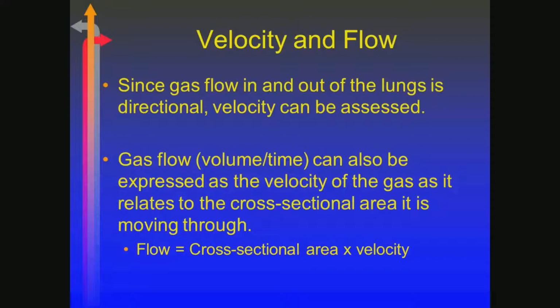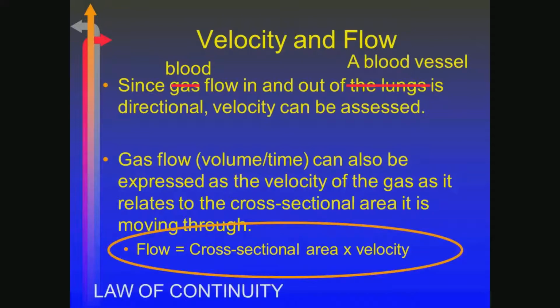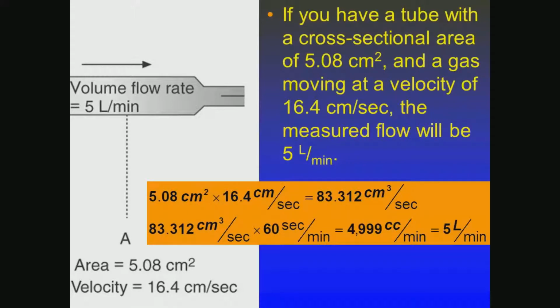The problem with the technology is we're making the assumption about the cross-sectional area of a person, which we determine based upon their height and their gender. That may or may not be true. If somebody has a calcified aorta or perhaps an aortic aneurysm, that measurement's going to be off in that case. But it is a good technology. And basically we're just using the same exact rule. Instead of using gas, we're using blood flowing through a vessel, and we can determine it. Vaguely remember this as far as how we would end up calculating it.